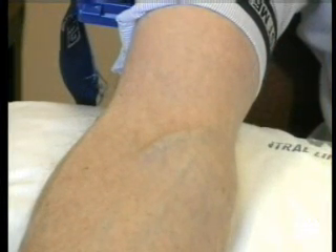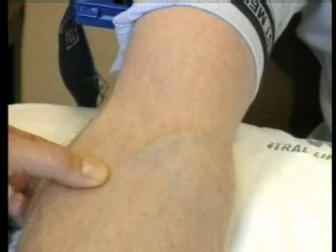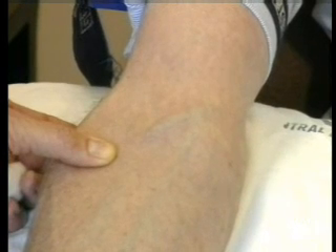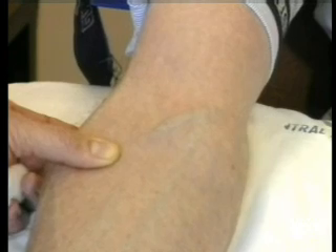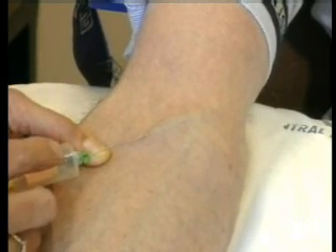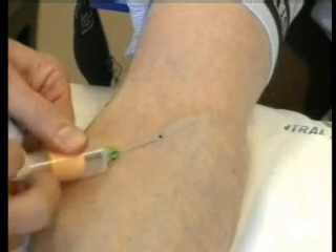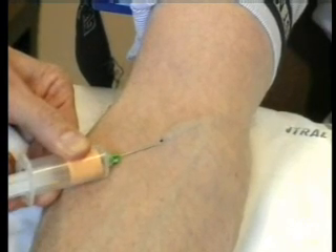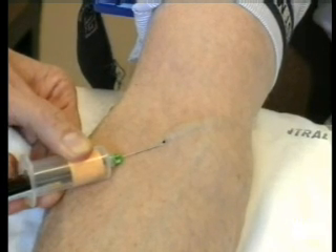Now we're going to go ahead and do the venepuncture. The important thing is to line yourself up completely correctly and apply slight pressure on the vein, but not so much that you obliterate it by pulling too hard. Then you approach the skin and slip the needle through the skin and up into the vein. You then watch it very carefully so that the needle does not move, and it's best to not change hands, although some people do so.